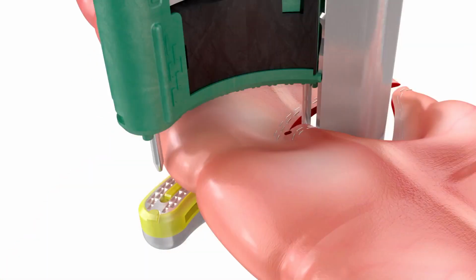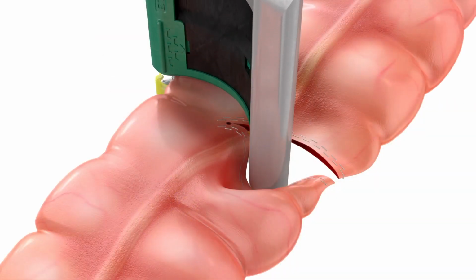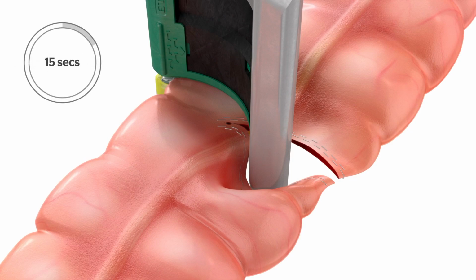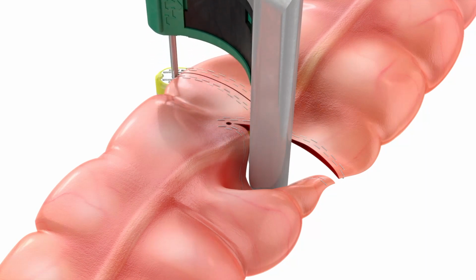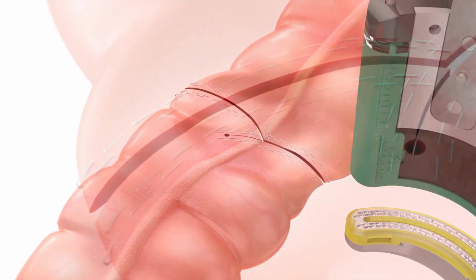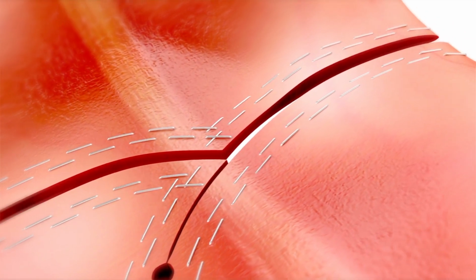Advance the retaining pin to capture the remaining tissue within the jaw opening. Close the device. Wait 15 seconds for adequate tissue compression and fire the device. Release the device and examine the tissue for hemostasis and proper staple formation. If hemostasis is not present, appropriate techniques should be used to achieve hemostasis.